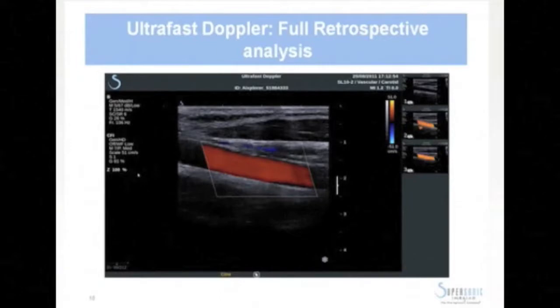So we put this one in the middle of the vessel, for example. We adjust the parameters. We put our angle. And we can do that for a third one. For example, let's put it here at the end of the vessel. And again, all these three are independent, so you can adjust the angle independently and switch between the three.